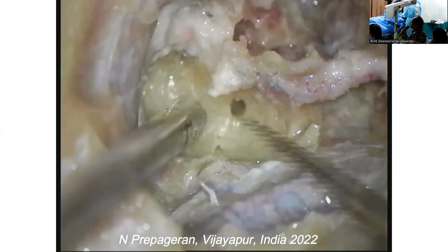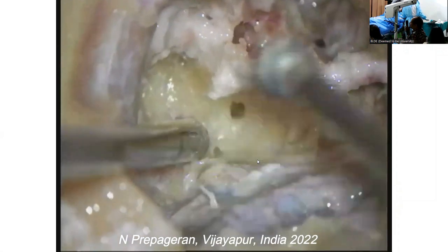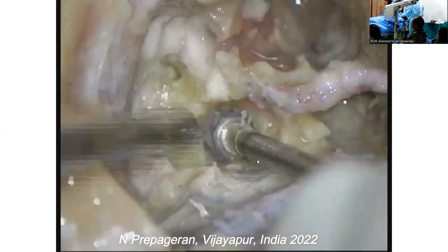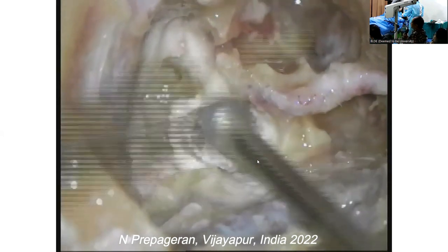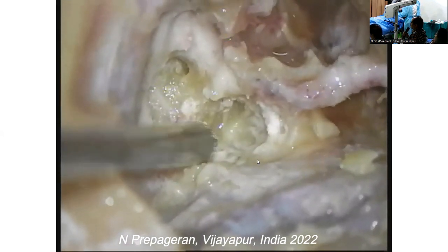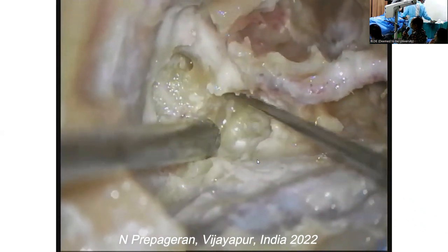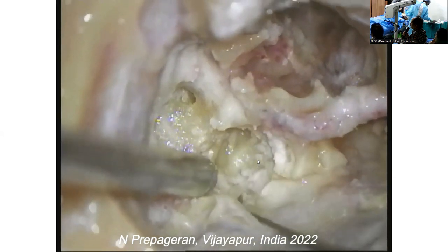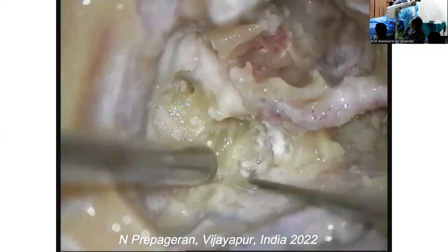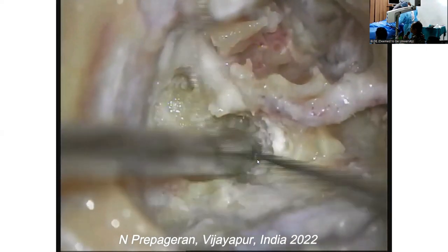This is your utricle. Okay? So you follow the utricle. Well, look at the size of the drill. You follow the utricle. Can you see? Now I'm inside the utricle. Okay, better give me a smaller drill. So if you look at the utricle now, what supplies the utricle will be your vestibular nerves. So all you need to do is follow and drill here. That will take you straight to the internal auditory meatus.